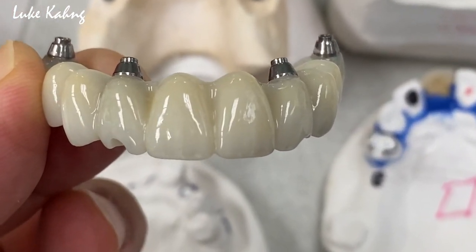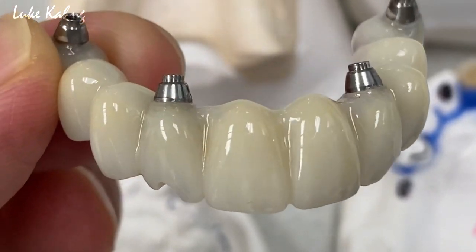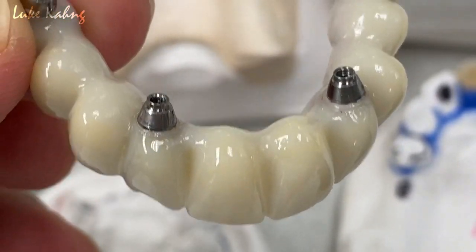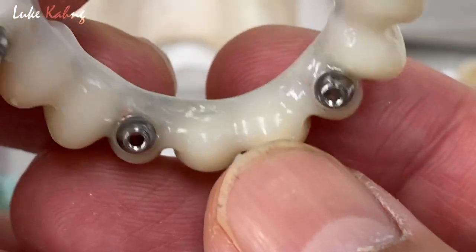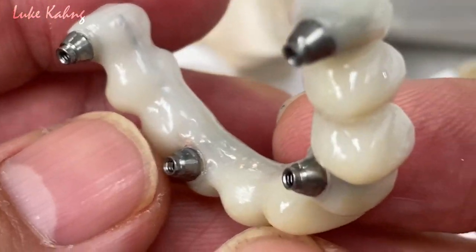Finally, we finished the nice long-term temporary bridge with the wire, and then we give them really exceptional contours underneath the pontic, which is more football shape.